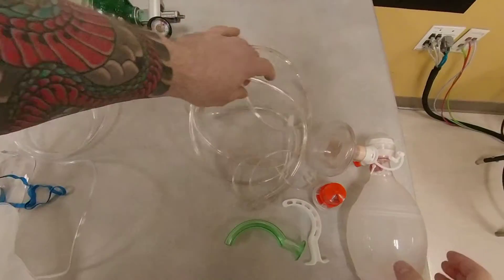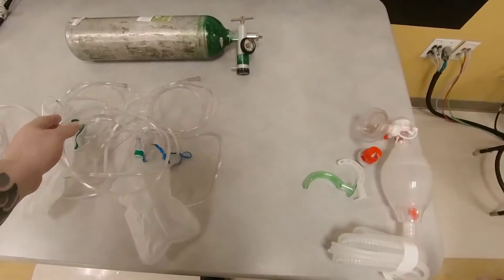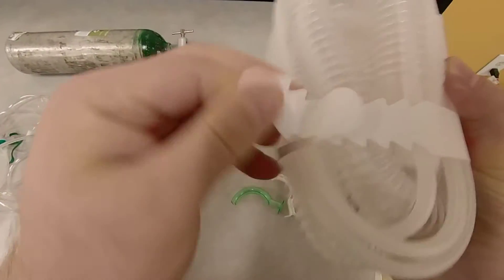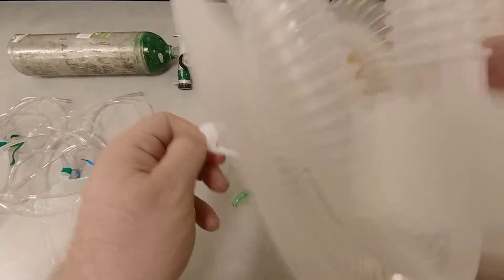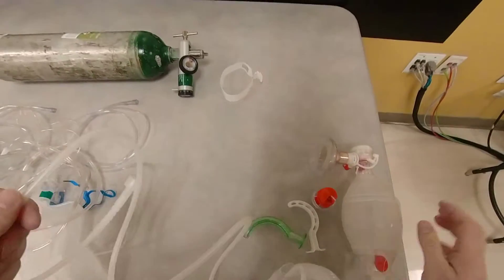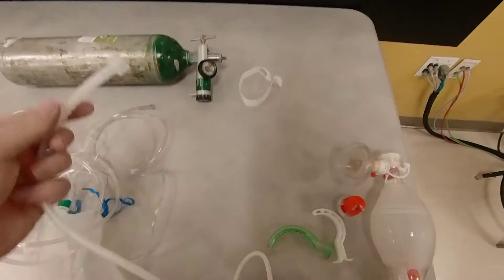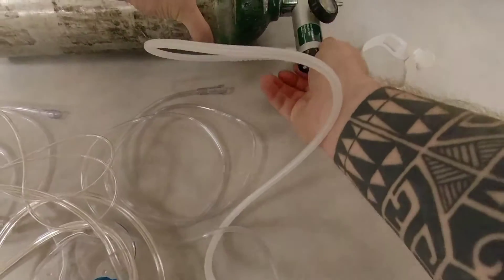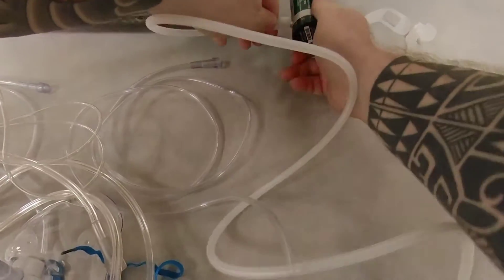So this device here is able to deliver greater than 90% FiO2. And really, you could get it to 100% FiO2. So let me connect this to my oxygen source. When can you get 100% FiO2? When you have excellent technique, and you are creating excellent seal. So what you want to do is you want to employ the triple airway maneuver. Let me turn this on to 15 liters.